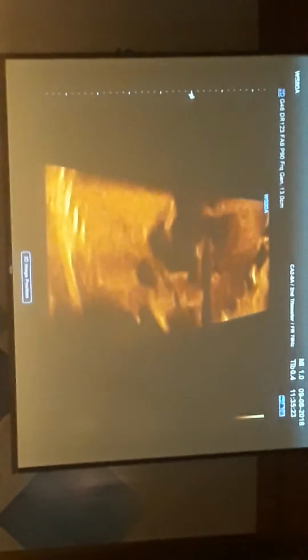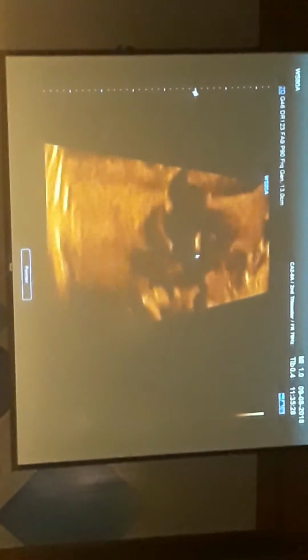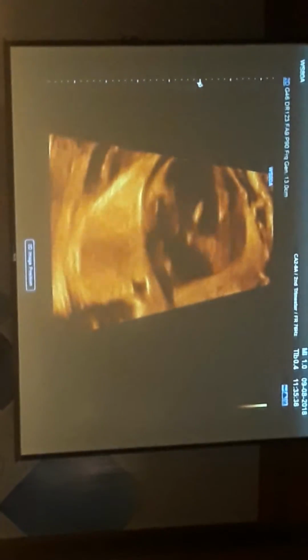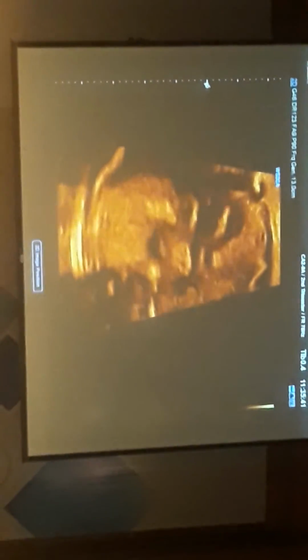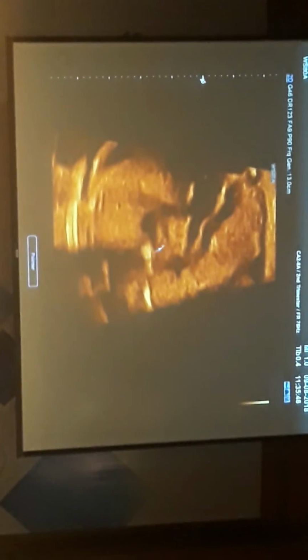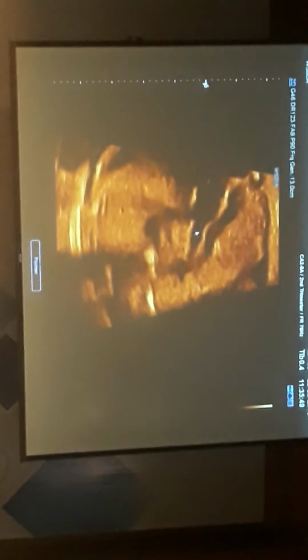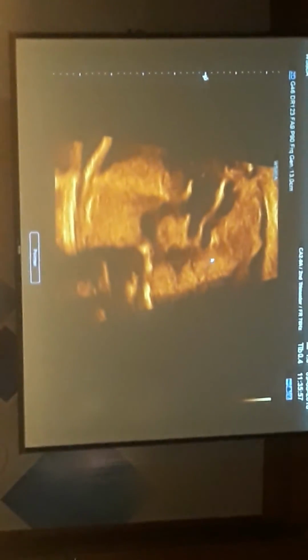Now I still have not seen, here's the SVC, but I still have not seen both pulmonary arteries. So now I'm going to see if I can see them from here instead of sagittal imaging. So here I'm seeing, looks like this is going to be the left pulmonary artery. No, I mean the right pulmonary artery. It's going towards the right. This is the right pulmonary artery.